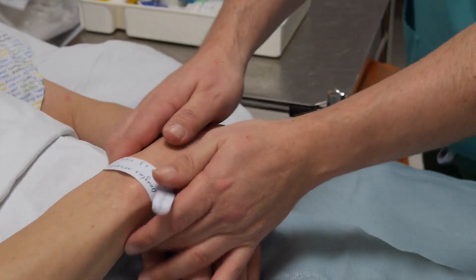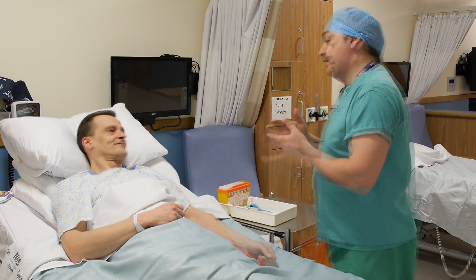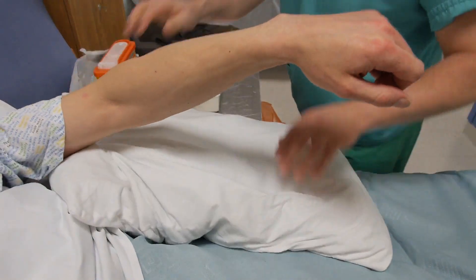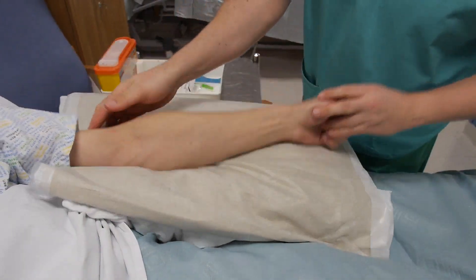Introduce yourself to the patient and verify identity. The procedure should be fully explained to the patient. Support the chosen limb on a pillow and ensure there is adequate lighting, ventilation and privacy.